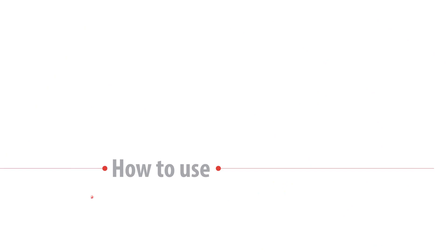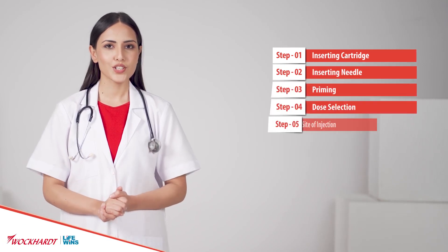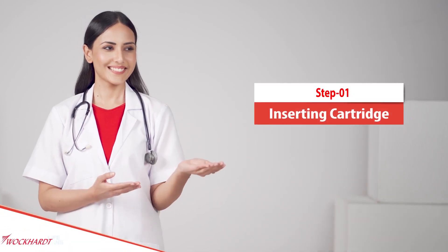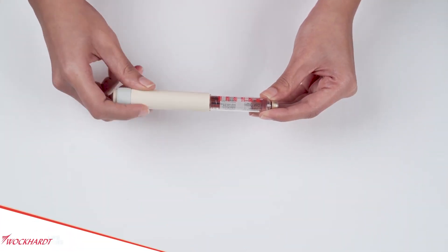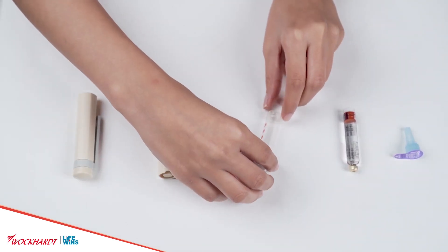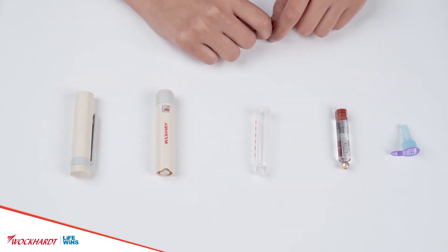How to use Vipox Pen? Carefully follow the step-by-step instructions to use Vipox Pen. Inserting the cartridge: remove the pen cap and unscrew the pen body from the cartridge holder. Ensure that the internal plunger is fully retracted.